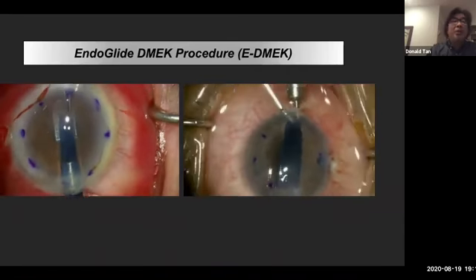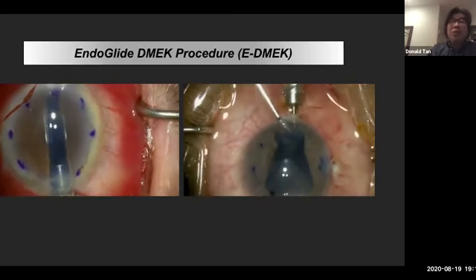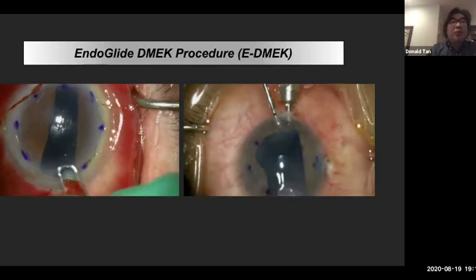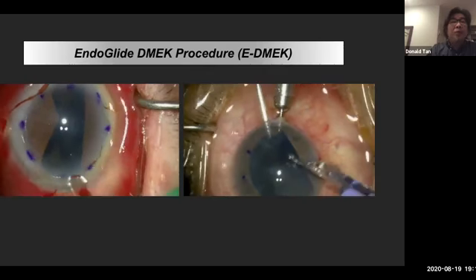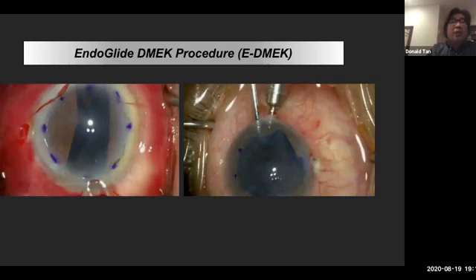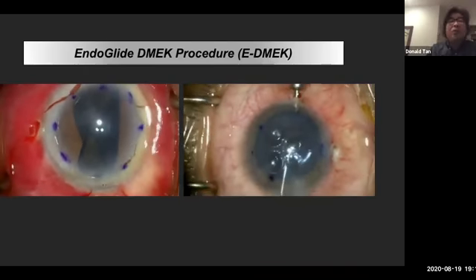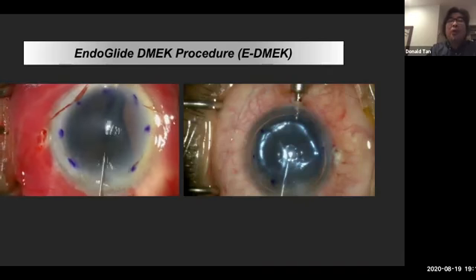tissue. And I'm basically bringing the tissue to your AC maintainer, which is on very, very low flow. The chamber is sort of semi-shallow here. And as you can see, it automatically starts to uncoil. And I'm using the tip of the endoglide really to just close the wound briefly each time to deepen the chamber, and that allowed the tissue to uncoil. And if one side doesn't uncoil, then you can just inject an air bubble underneath. So this creates quite a lot of control in the situation. You can have challenges sometimes, but generally a lot more control and less risk of donor eversion.